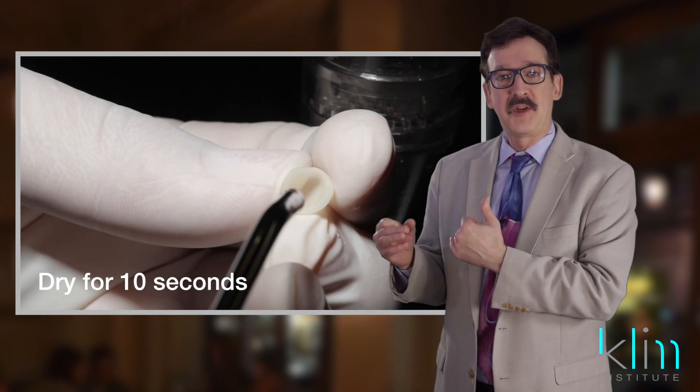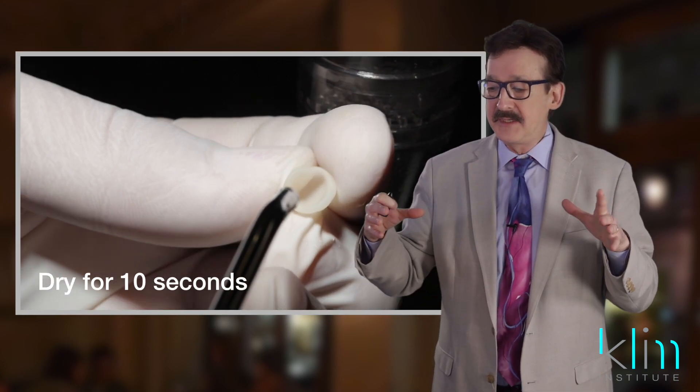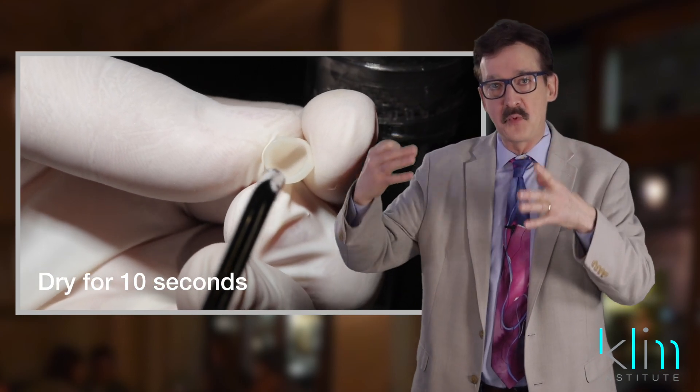One of my objectives in the clinical theater is to do the same step the same way every time. If I can take those steps and condense them to make them streamlined, it sure makes the flow of my day go a lot easier. Thank you Ivoclar — I think you hit a real home run on this one. It's a great product, got to try it.